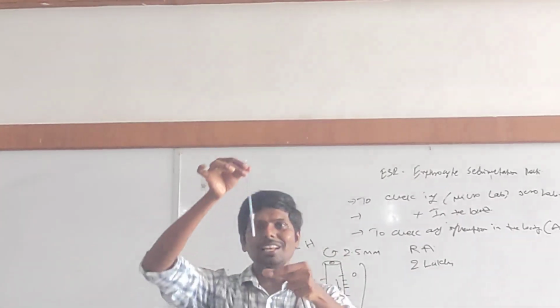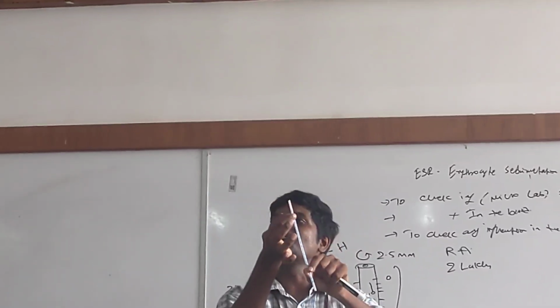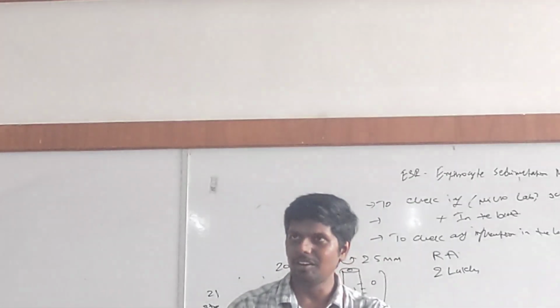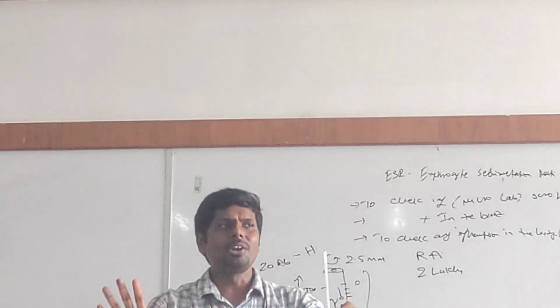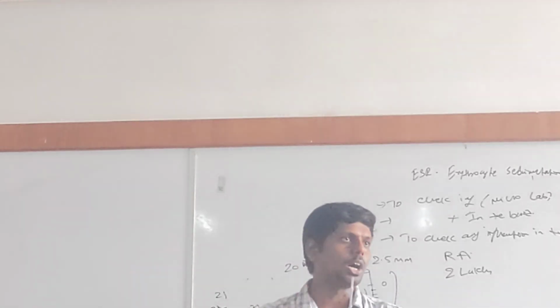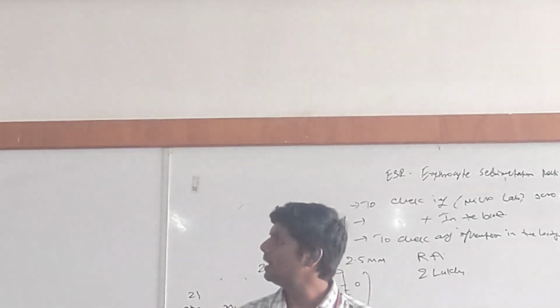So take a blood vial, insert this, and automatically the blood will elevate up to what mark? 0. Why did it stop at 0? Because there is a stopper, and you will keep this in the blood vial for the next 1 hour. After 1 hour, what happens? The red blood cells will sediment, and you will get a gap at the top. Is it clear? Yes, miss.